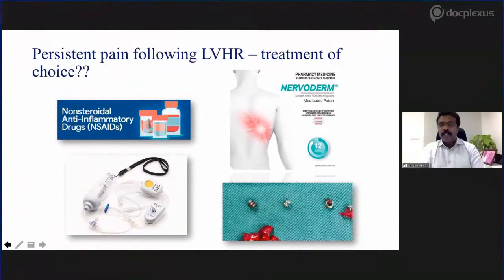Exactly. We have to measure, because even though ultrasound or CT can give the size, in my opinion the intraoperative measurement is much more important. Even with a primary hernia, sometimes small secondary hernias will be there. We should not miss them when we are displacing the peritoneum or falciform ligament; we will come across small hernias. Even the size of the hernia intraperitoneally will differ from externally. So all combined together, it will be useful, which is my opinion.